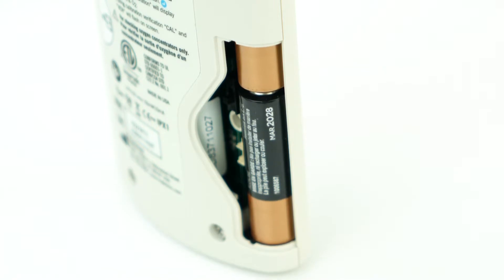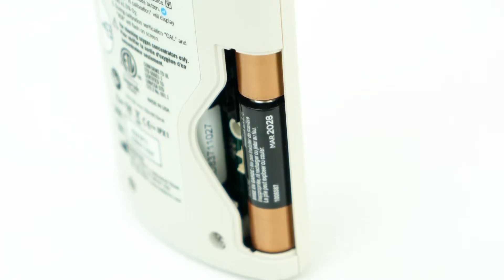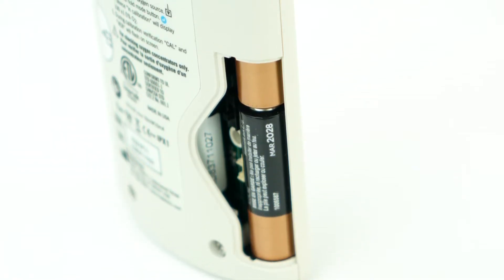Powered by just two AA batteries, the Ultramax O2 can function for up to 1100 hours of use. A low battery icon will appear on the screen so you know when you need to change the batteries in advance.